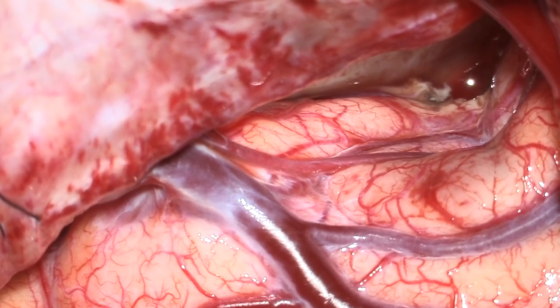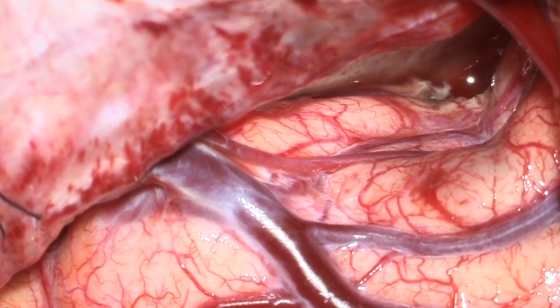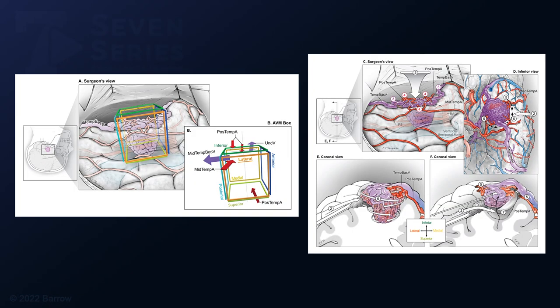Here is the final overview showing the subtemporal exposure and nice preservation of the vein of Labbe. This case is a nice example of a basal temporal AVM. These basal temporal AVMs present to the basal surface of the temporal lobe. They're typically fed by posterior temporal arteries coming from the ambient cistern, and might also be fed by middle temporal arteries from the lateral cortical surface. The subtemporal approach gets us to the neighborhood, where we find the draining veins and feeding arteries, and circumdissection delivers the nidus from the basal surface into the subtemporal corridor.